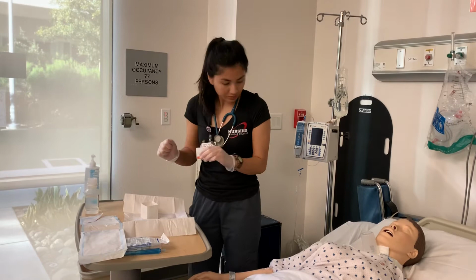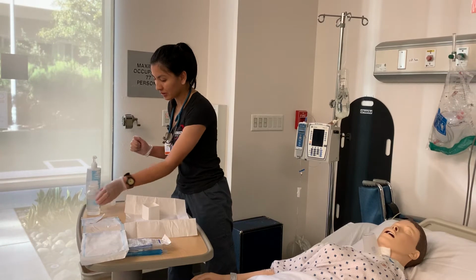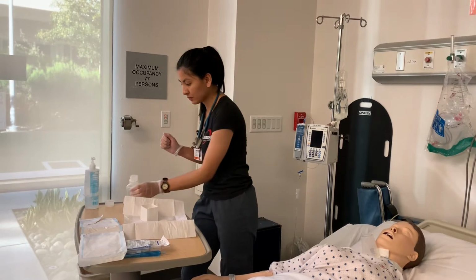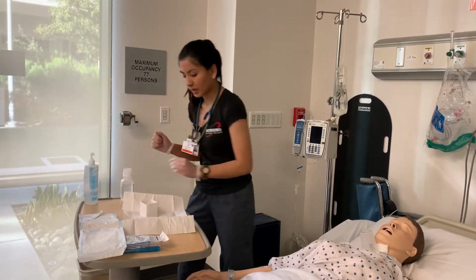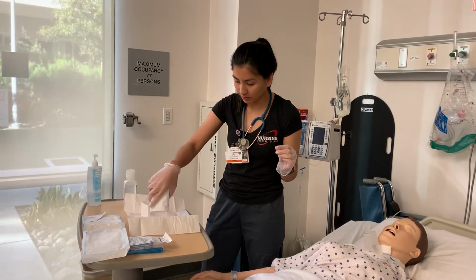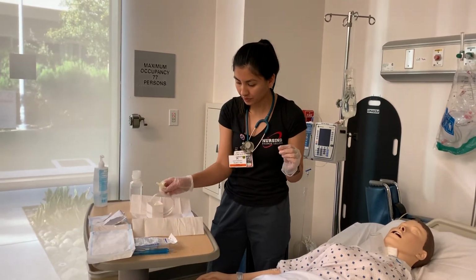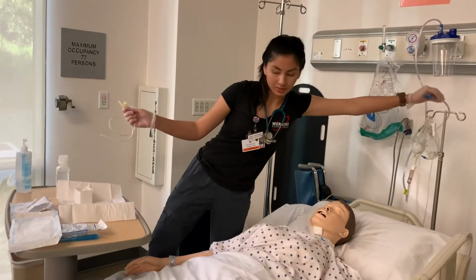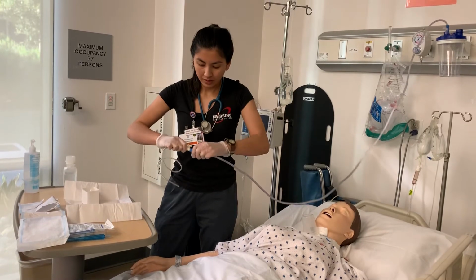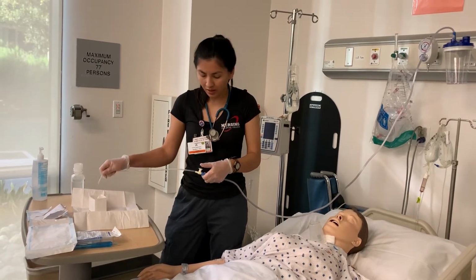Okay, so then with my non-dominant hand, I'm going to grab my saline water. And this is the hand that's going to be dirty, and I would pour saline water in. And then I put my dirty hand. Alright, so I would dip the suction, and then I would attach. And then just to make sure that it's working, I go ahead and test out my suction, and it's working.